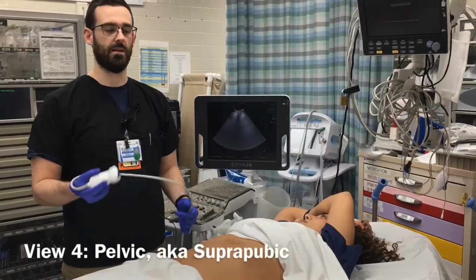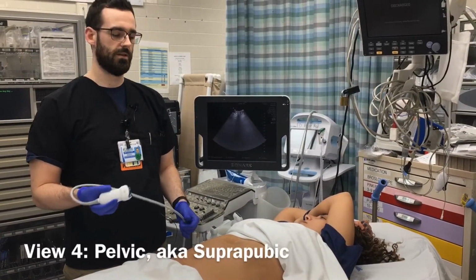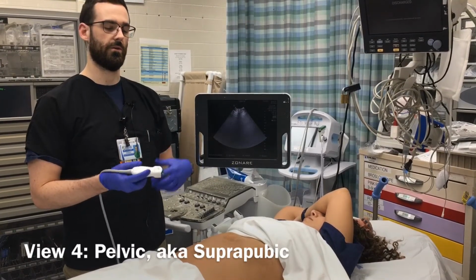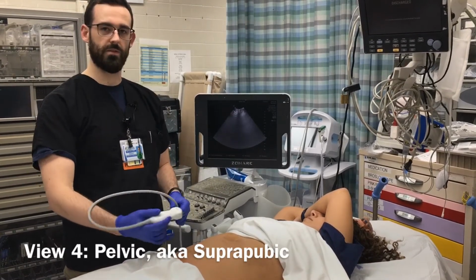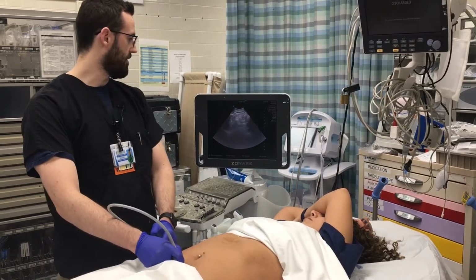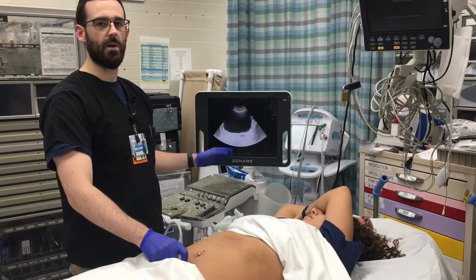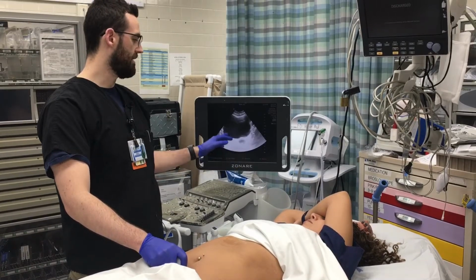Alright, the next spot and the last spot is the pelvis. So what you want to do is make sure, again, your probe marker is to the patient's right or your left. You want to go directly above the pubic symphysis, and you want to aim down looking for the bladder. A lot of times your depth is going to be too high, so you want to decrease your depth so you get a good view.